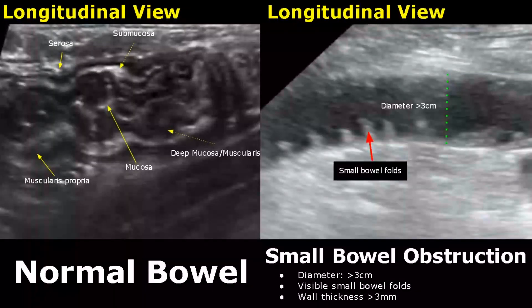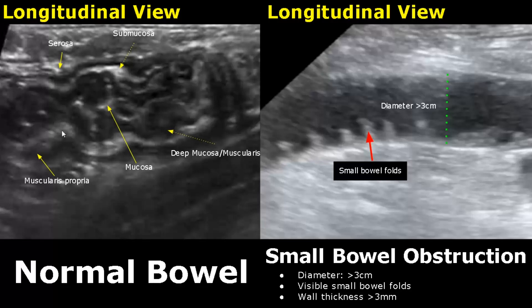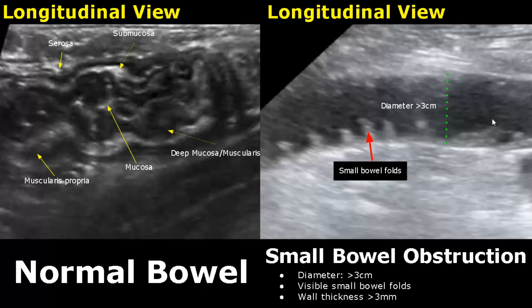Here we have an image of small bowel obstruction. This is the normal bowel with all five distinct layers. The diameter will be more than three centimeters. We will also see the small bowel folds — they will become visible in case of obstruction, and the wall thickness may also be greater than three millimeters.